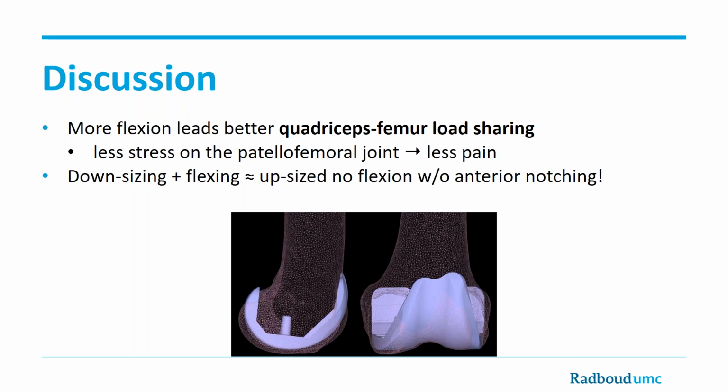To summarize these results, we saw that flexion leads to better quadriceps-femur load sharing, and as I said, this could be beneficial for patients because it can help prevent pain in the patellofemoral compartment. And as a take-home, the option of downsizing and flexing the femoral component can result in similar results as an upsized component with no flexion, but it comes with the advantage of preventing notching. Therefore, it's a very valuable option that could be explored to prevent this problem.